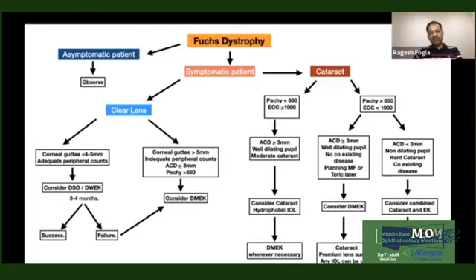Now, the question is whether to use premium IOLs in this coexisting disease. Well, if I'm doing a combined surgery, I don't like to use a multifocal lens. And even a toric lens can sometimes be a bit challenging, because when you manipulate the donor lenticule to move it into position, you tap the cornea, and there is a possibility that your toric lens within the bag can rotate from its desired position. So when I'm doing a combined procedure, I like to use a monofocal lens.